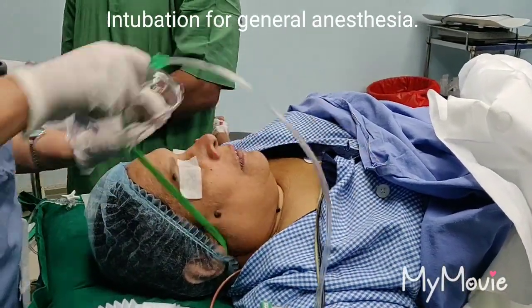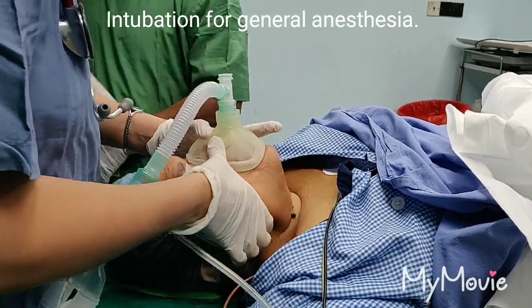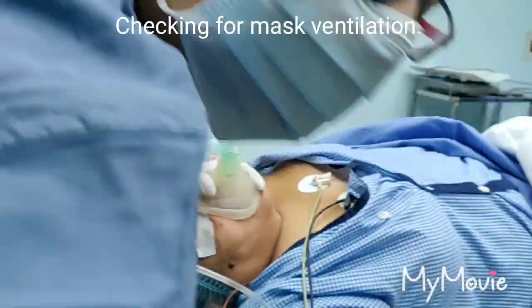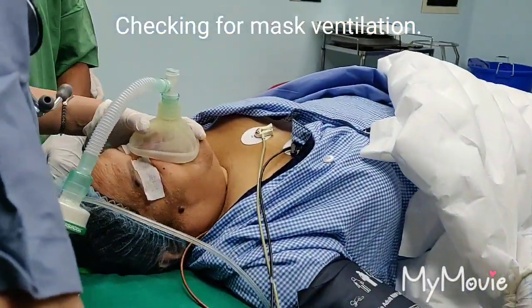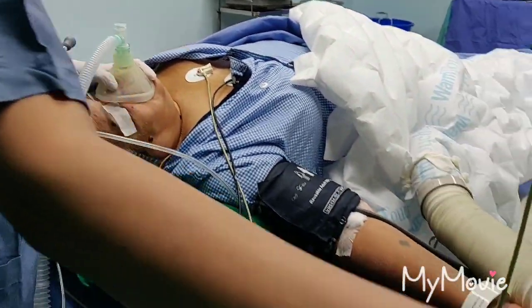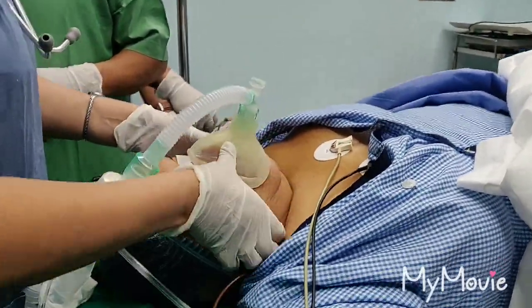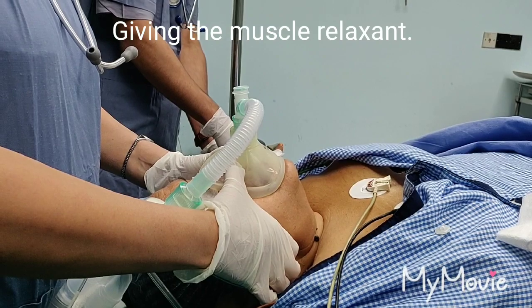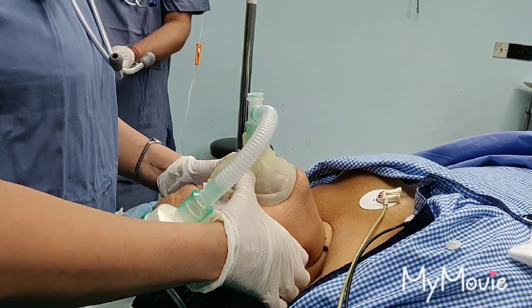We will start now. We are going to check for mask ventilation. Easy to ventilate. Putting on ventilator. Put the timer on. We are getting the ETCO2. Ventilation is good.